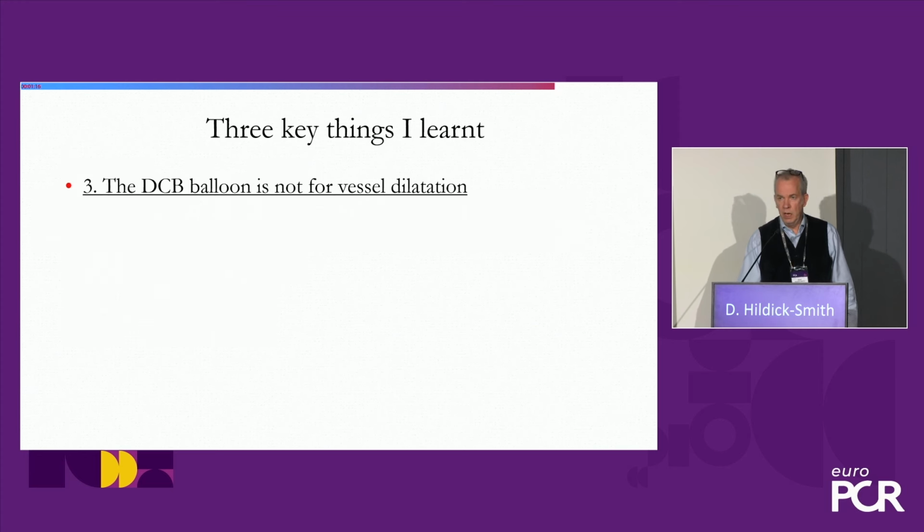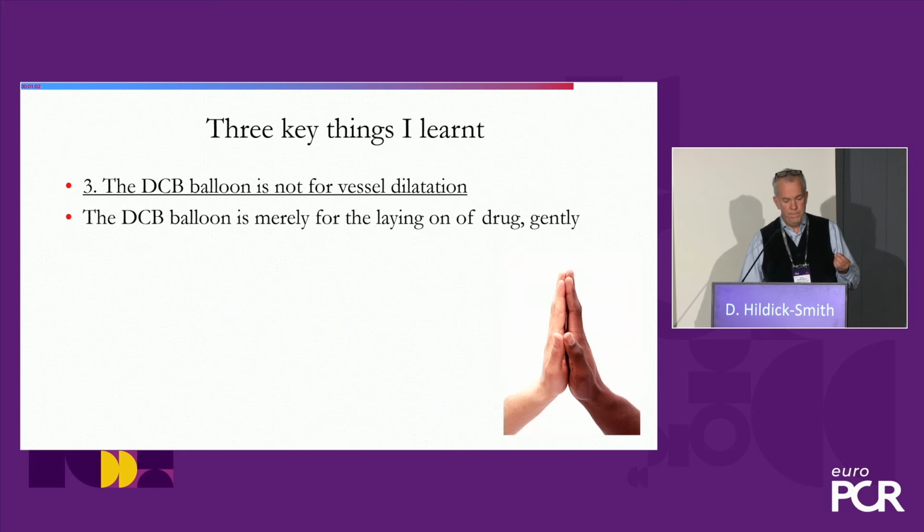And the third thing I learned is that the balloon, the drug-coated balloon, is not actually for vessel dilatation. So it's a sort of a misnomer. Yes, it is a balloon, but you're not using it to dilate the vessel. All you're trying to do with the balloon is lay the drug on the dissected inside of the blood vessel to allow prevention of the restenotic process.